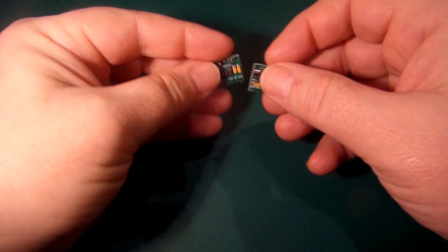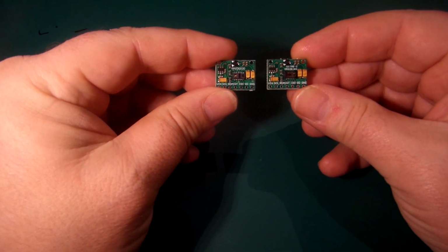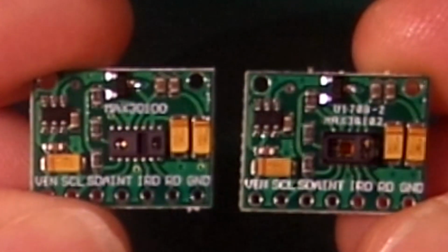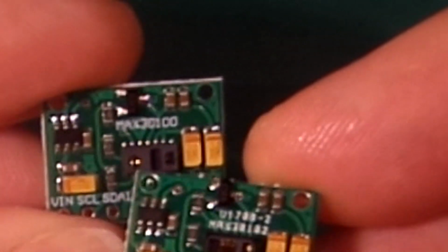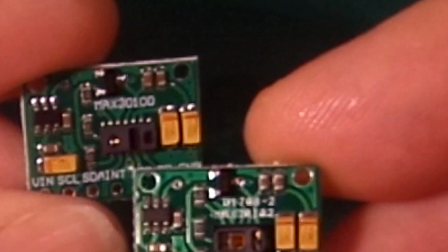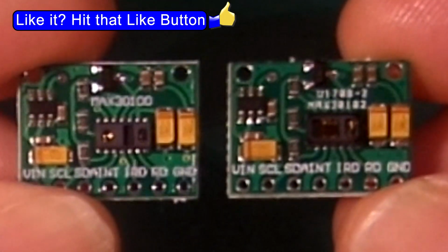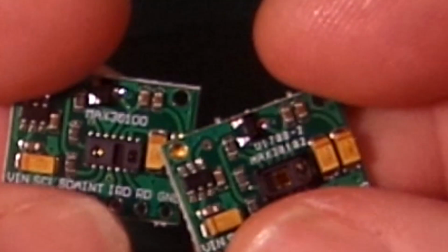So let's see what the physical differences are. If we examine the circuit boards on these, zoom in as well, if you look at the tracks and the components, they are identical. You may notice a subtle difference in the main sensor device here compared to this one. As you can see, there's a little glass window there and there on these. But apart from that, the components are identical. The circuit tracks on the back are the same. So what makes one different to the other?